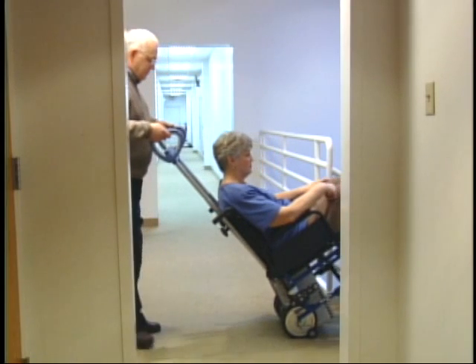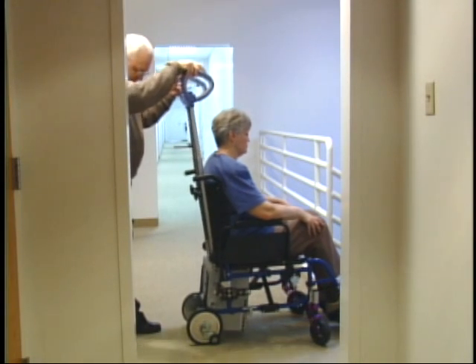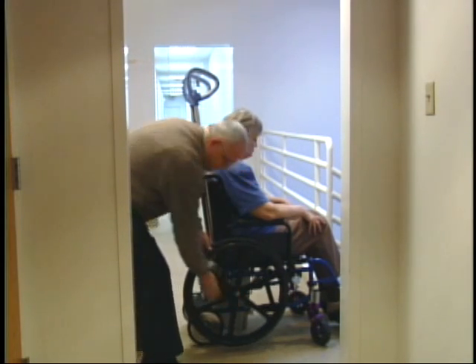At the top of the stairs, bring the wheelchair into a level position. Raise the Scattermobile slightly off the ground, allowing the manual wheels to be placed back on the wheelchair. Notice the passenger remains seated in the wheelchair without having to transfer.